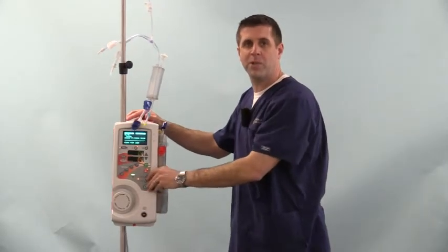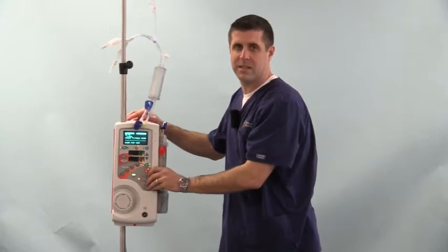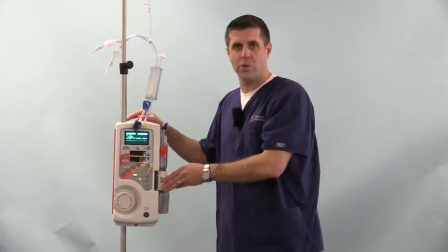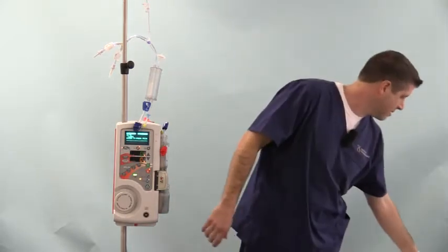I'm going to open the pump door and push the roller pump tubing all the way to the back. This is an important step. And then close the roller pump door. Now it's self-centering, and now I've just got 3 easy connections and the priming sequence. So let's do those connections.